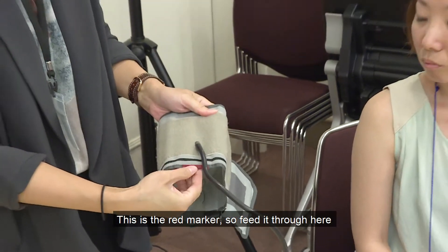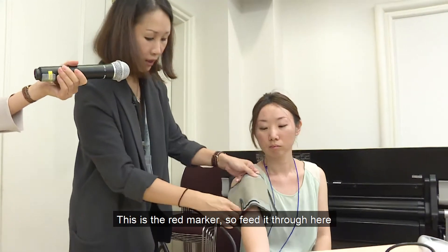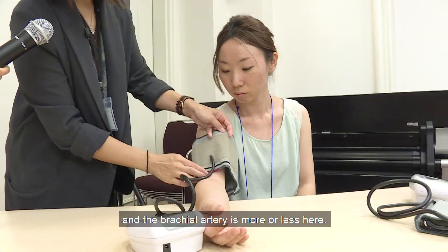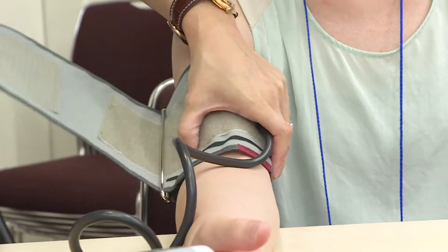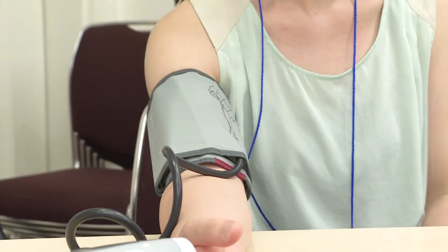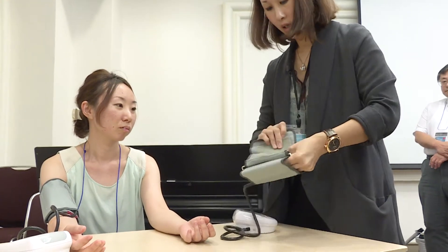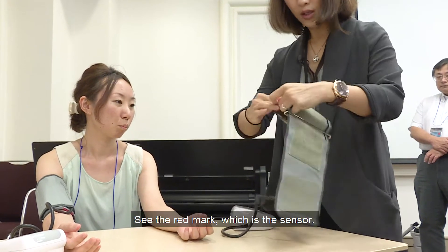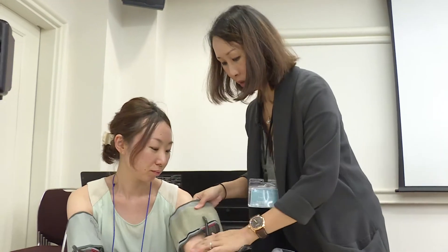So this is sort of like the red marker. I'm going to feed it through here. The brachial artery is more or less here. There's the other arm. You see the red mark, which is the sensor for the brachial artery.